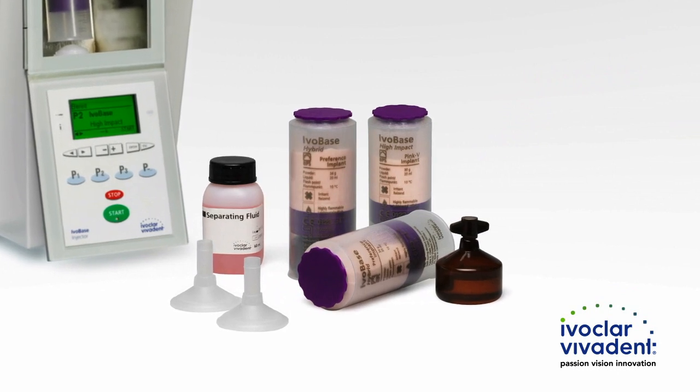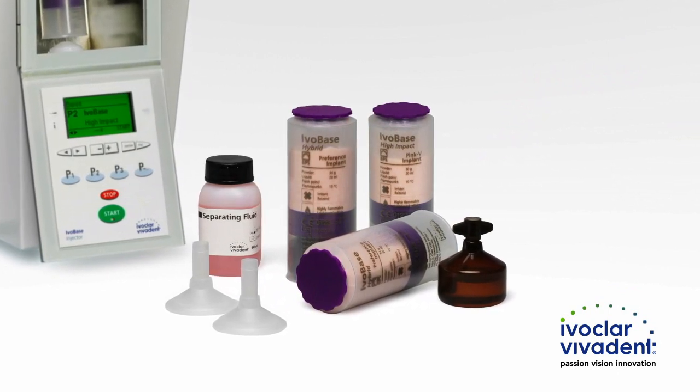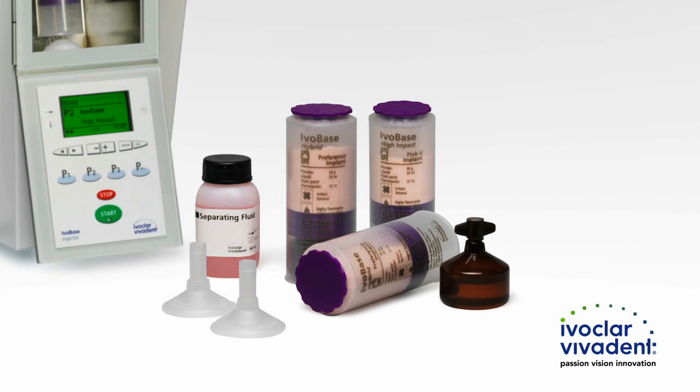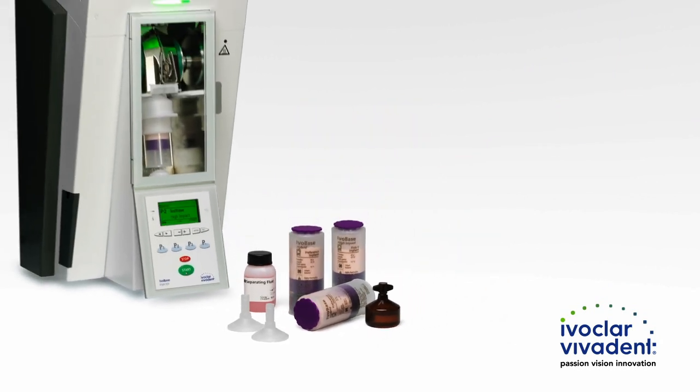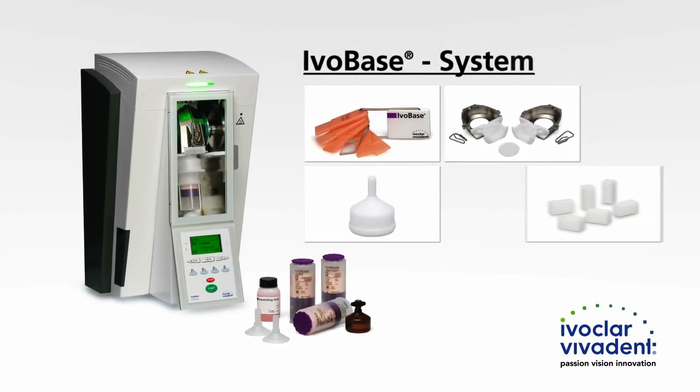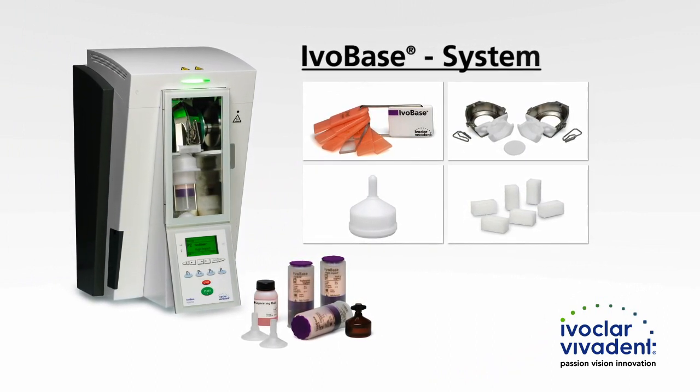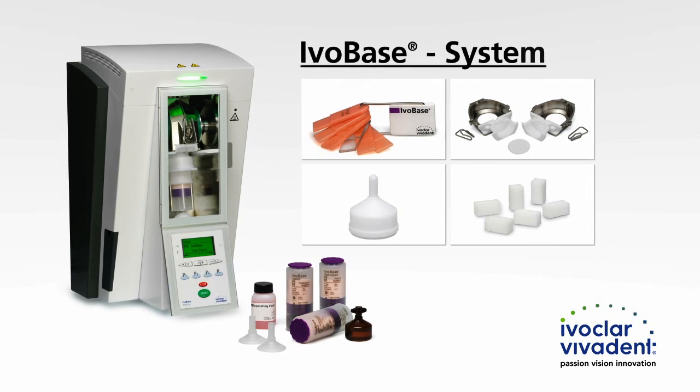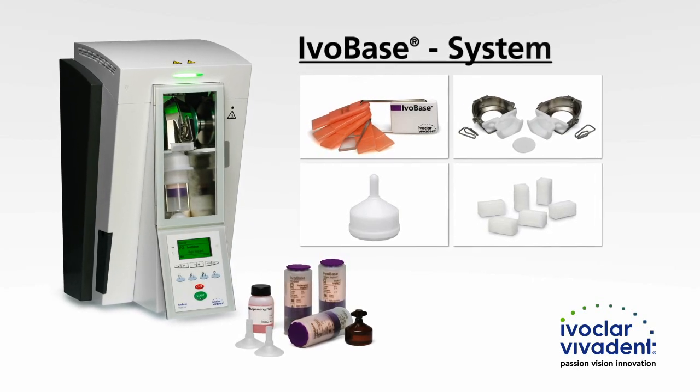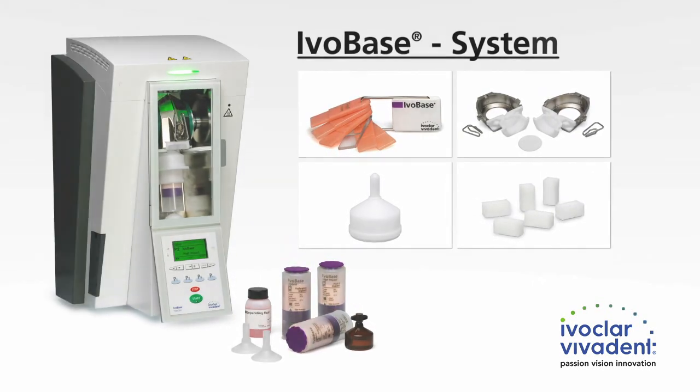The IvoBase material is available in two versions: IvoBase Hybrid and IvoBase High Impact. This instructional video introduces you to the use of the individual system components and points out special features. Please refer to the instructions for use for more detailed information.